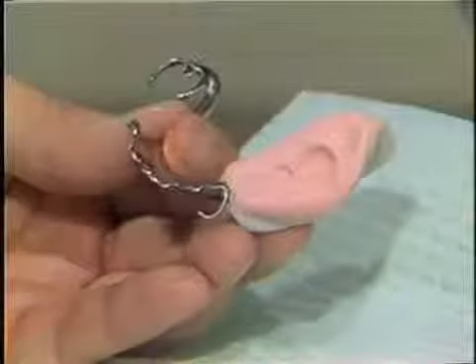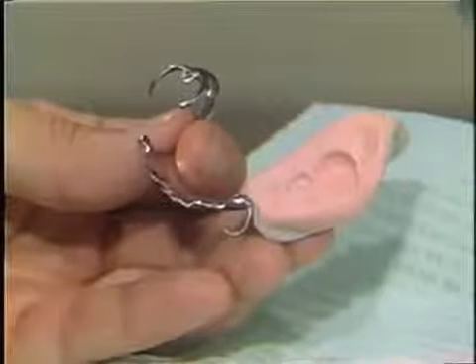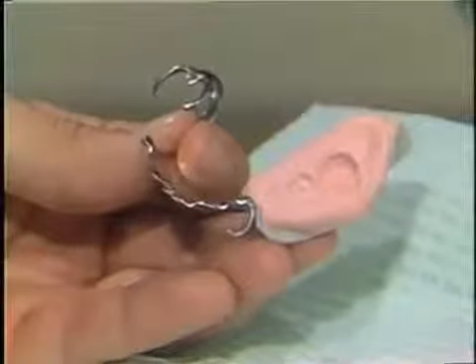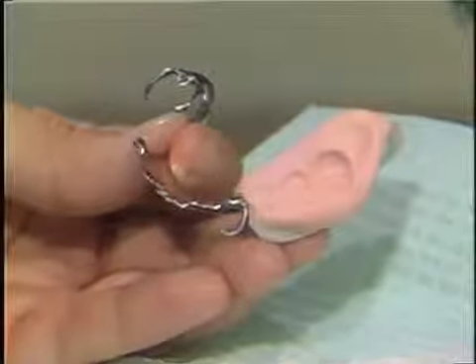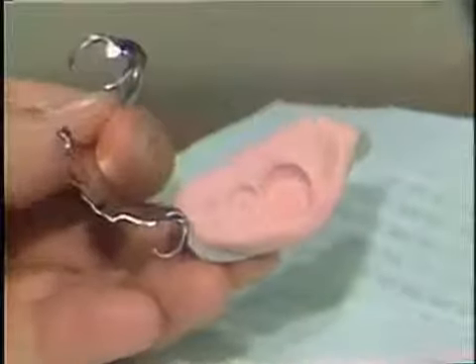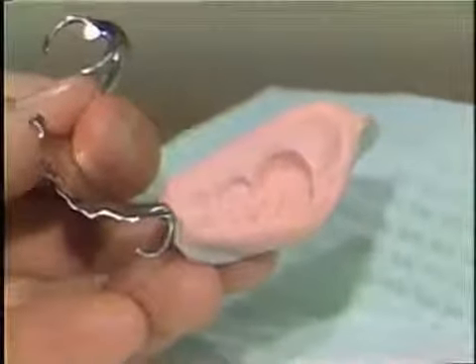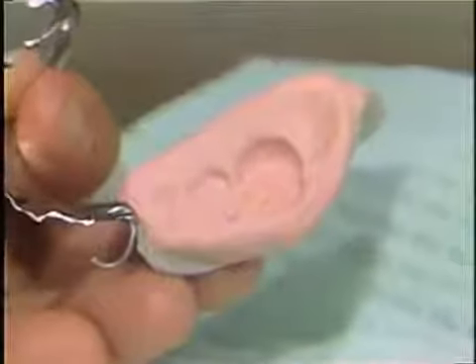The acrylic has now polymerized, and we have the indentations of the opposing dentition in the centric occlusion position. Now this acrylic is merely to form a table for a wax which is going to record the dynamic movements of the patient.